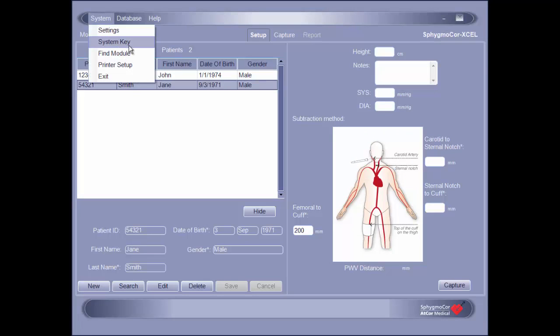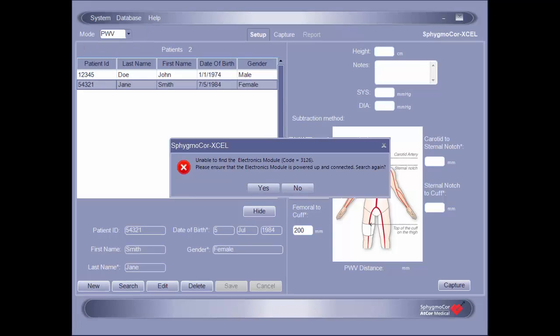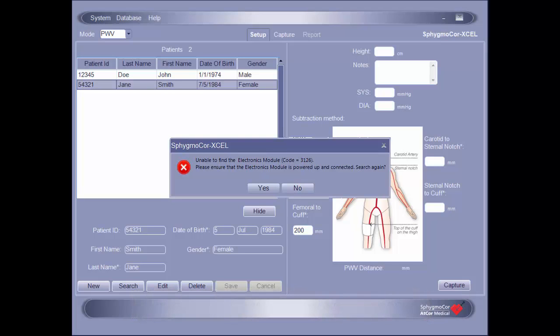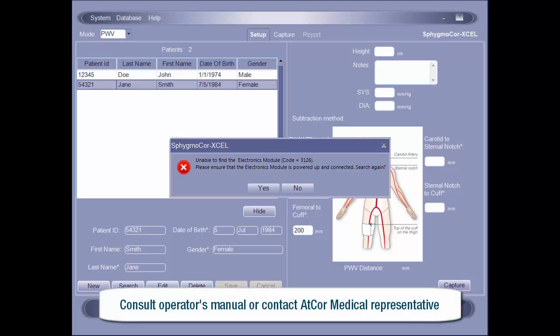If an error message appears, this indicates that communication could not be established. In this case, ensure that the USB cable is properly connected to both the module and the computer and that the module is powered on. Once confirmed, reattempt the Find Module function. If communication still cannot be established, consult your operator's manual for further troubleshooting suggestions or contact an ATCOR medical representative.